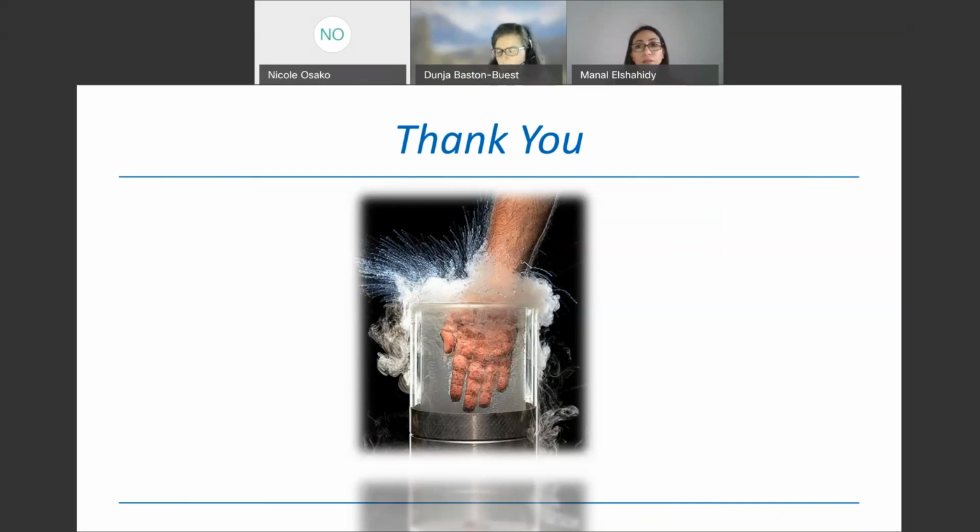Another question: what if the receiving country has a requirement that commercial solutions are required per the SOP, but the particular warming solution is not available in the country? What is your suggestion or experience? It might be possible to also send just an aliquot of the thawing kit, for example.